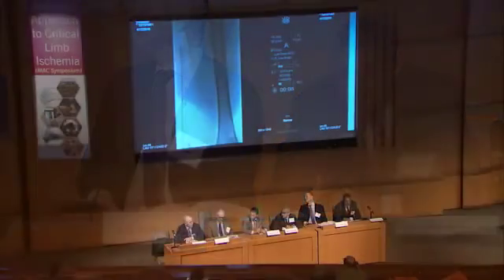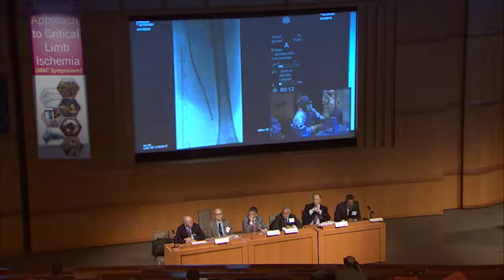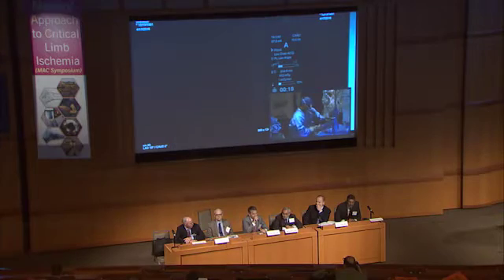Well, I think particularly when we're talking about a covered stent, where flow through any kind of prosthetic bypass or a covered stent is really important, good flow. And if you have differential flow down the profunda femoris because of the AV fistula, then that viabahn is going to be more prone to thrombosis, and then you're going to really have a tough situation.